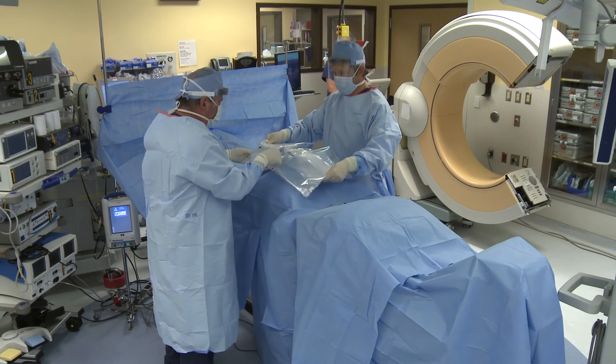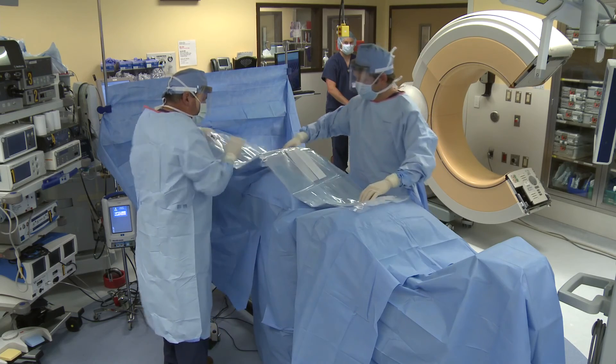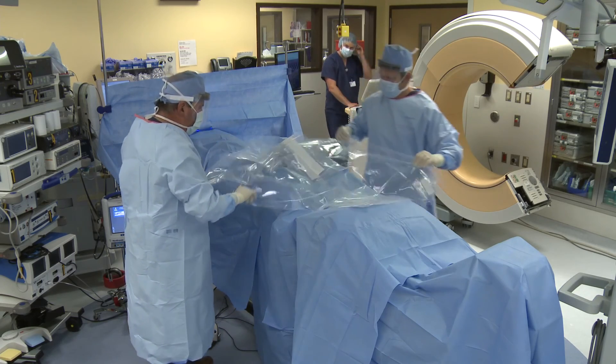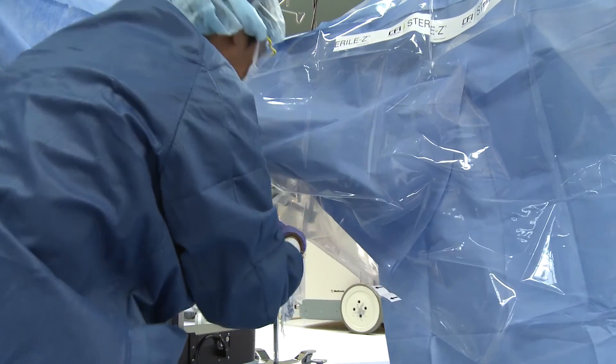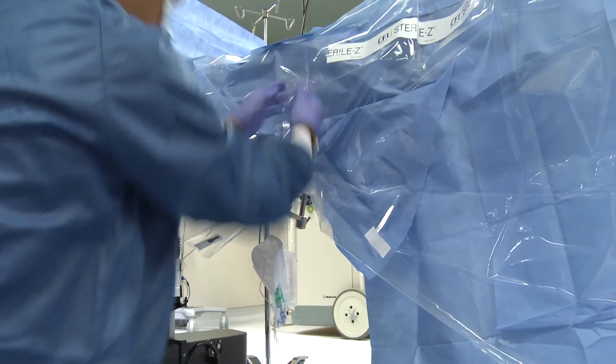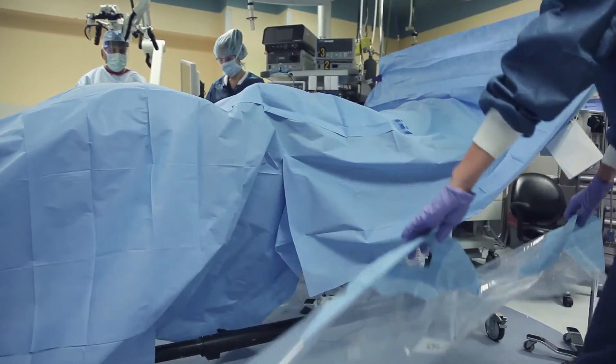The SterilZ patient drape is a product that tries to accomplish the task of increasing safety and efficiency. In every surgical procedure, we look for ways to increase safety to the patient when it comes to potential breaches in sterility that can be a risk factor for surgical site infections. And we look for ways to be more efficient, which gets the patient off the operating room table quicker — which is safer for them — and it also decreases costs for hospitals.